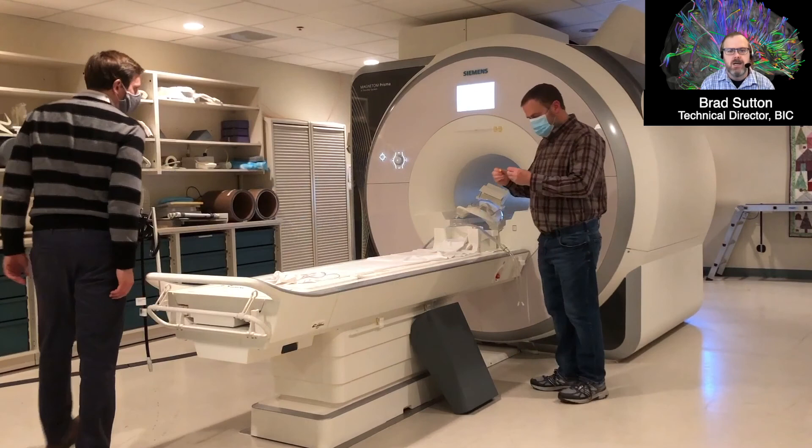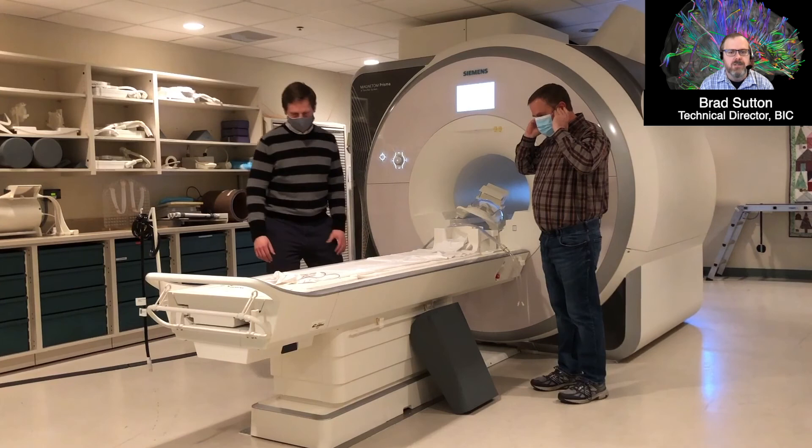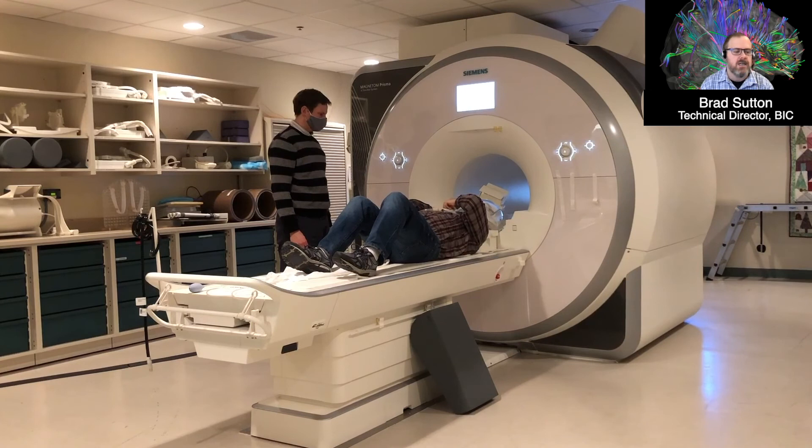The purpose of this video is to show how a functional MRI scan is done at the Biomedical Imaging Center at Beckman Institute. We use functional MRI to see how different parts of the brain are involved in different tasks. By giving people a task while they're in the scanner and watching images of their brain, we can tell what parts are active and how the brain acts differently — as you get older, with various interventions, or with different diets and exercise.